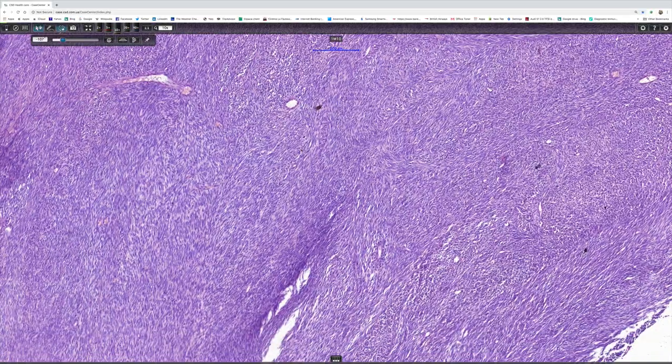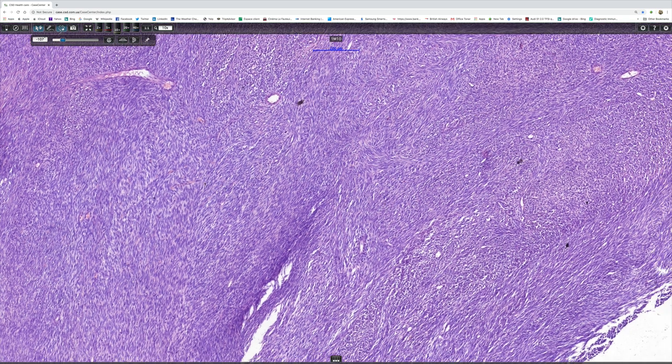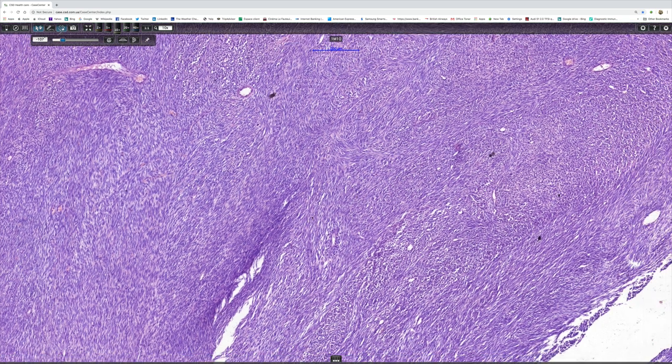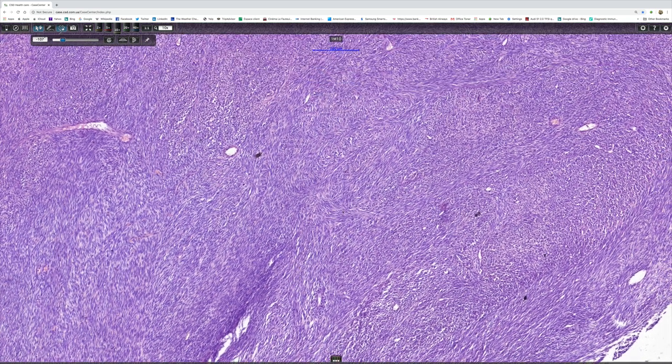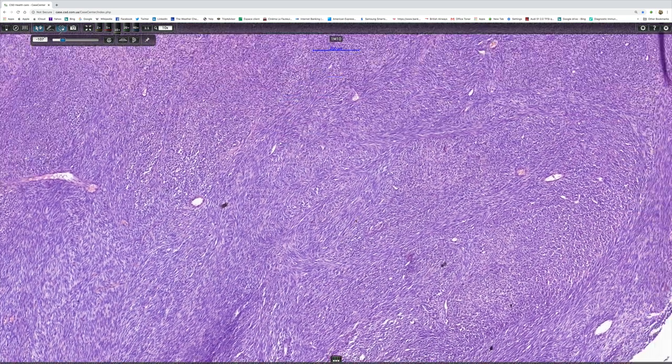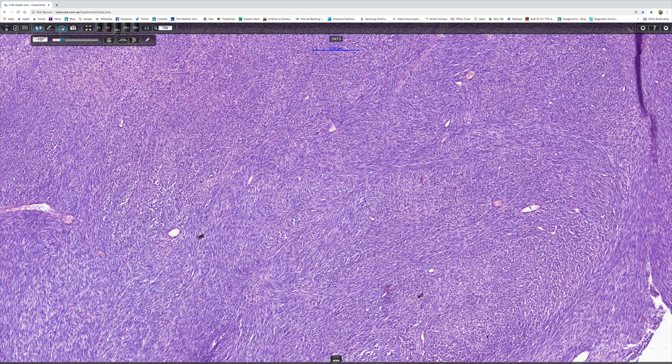First thing that comes to my mind is it has to be nowadays a monophasic synovial sarcoma, because that's what this looks like. And in fact that's exactly what this is.